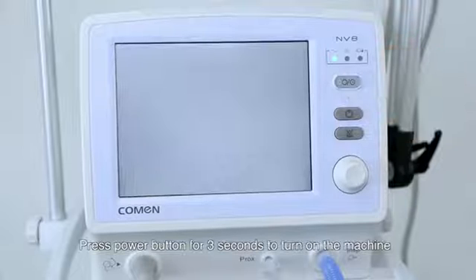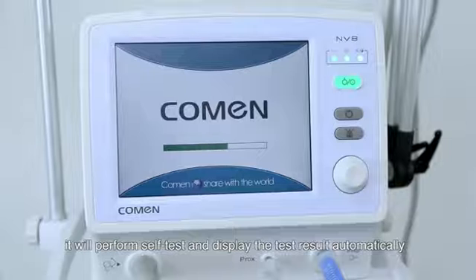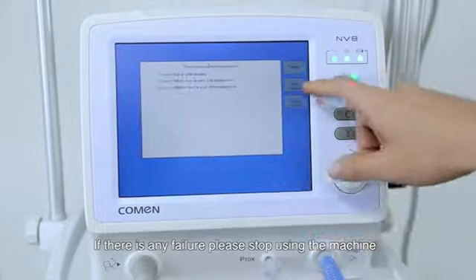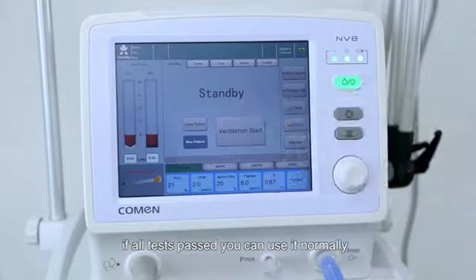Press the power button for 3 seconds to turn on the machine. It will perform a self-test and display the test result automatically. If there is any failure, please stop using the machine. If all tests passed, you can use it normally.